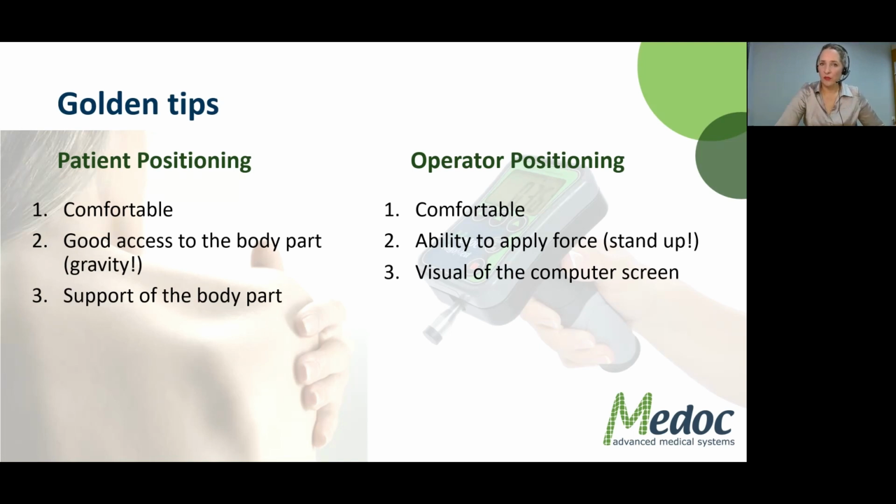Not a minor point, but something that you have to keep in mind. I want you to have a visual of the computer screen, because the computer screen is giving us the feedback about how we are doing in applying the pressure at a steady rate and in a steady state. So you need to see the computer screen quite well when you're doing the testing.